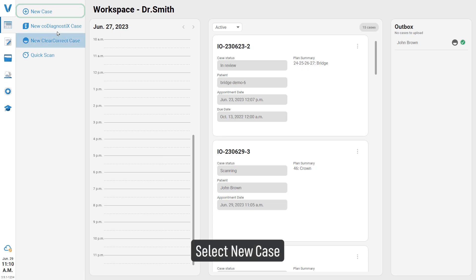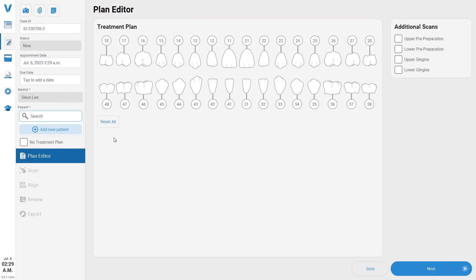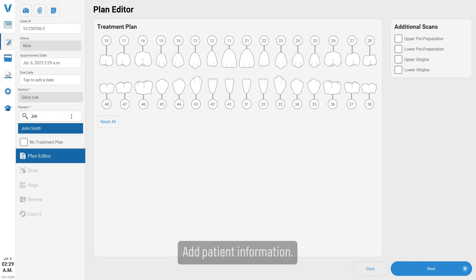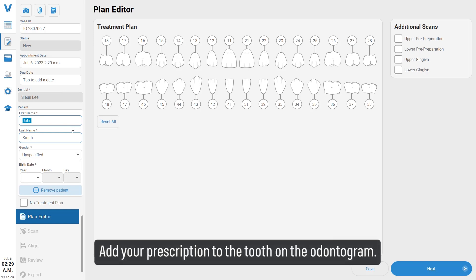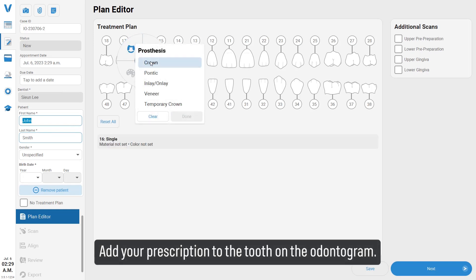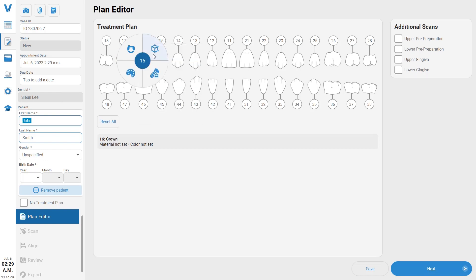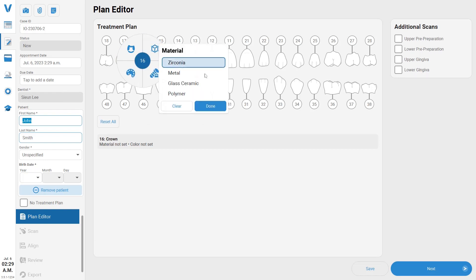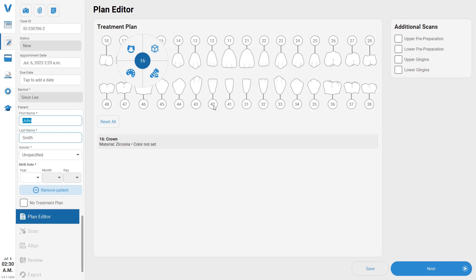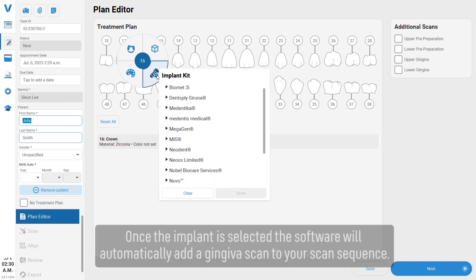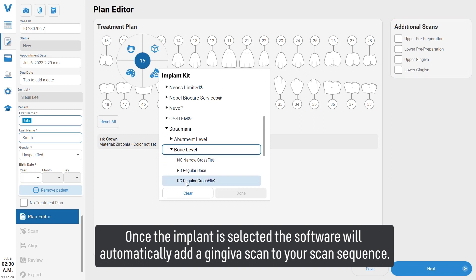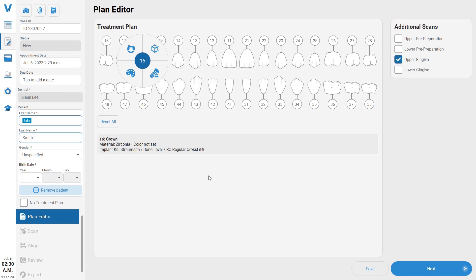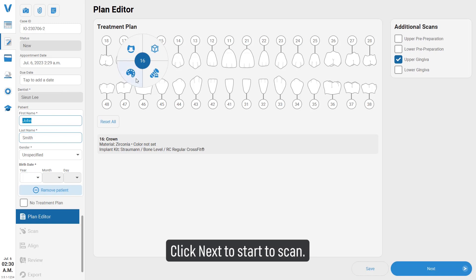Select new case, add patient information, and add your prescription to the tooth on the odontogram. Once the implant is selected, the software will automatically add a gingiva scan to your scan sequence. Click next to proceed.